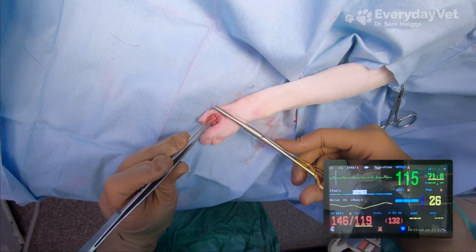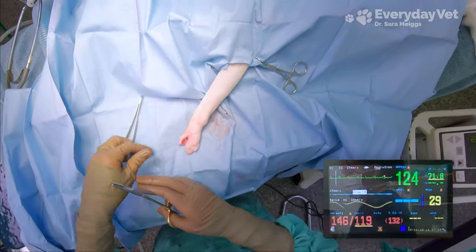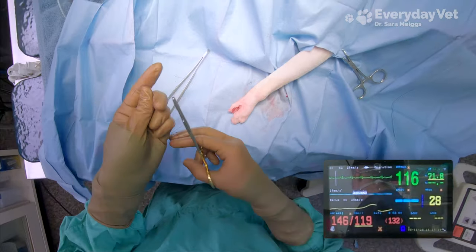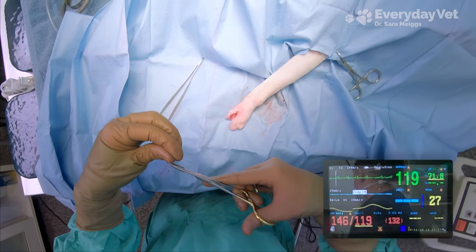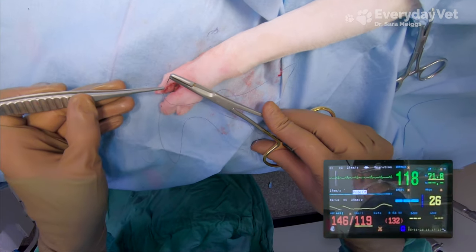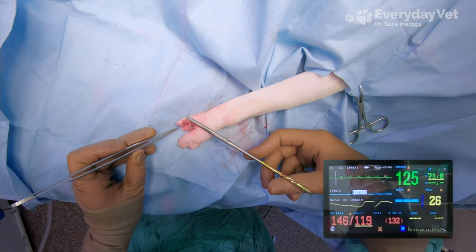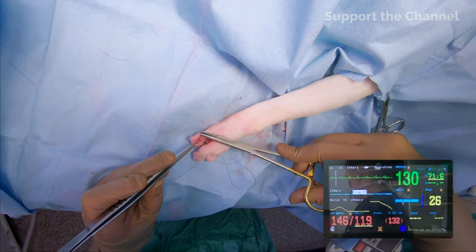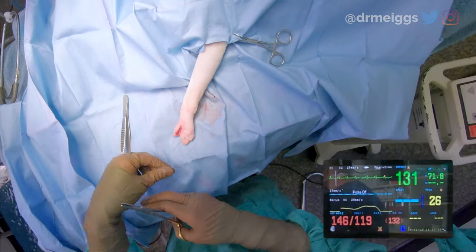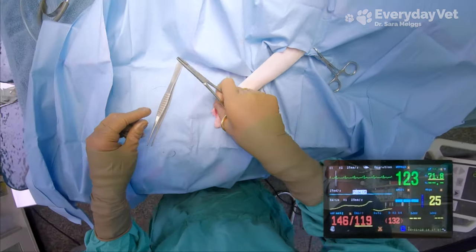Looks like the Cardell just gave us a new blood pressure — wow, it's not reading hypotensive. But I'm not really panicking because I don't even slightly believe that number. The thing with machines is that there's always room for error — no machine is perfect, so it's really important that we're keeping an eye on things and paying attention. No way did this pet just go from being pretty hypotensive the whole surgery to now being very high, so I'm not going to trust this reading. I'm going to keep a close eye on it and see what the next reading shows. You never want to make your judgments based on one blood pressure reading, because it might not be accurate.